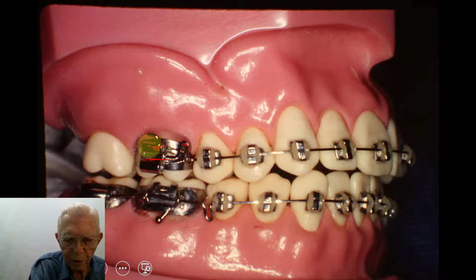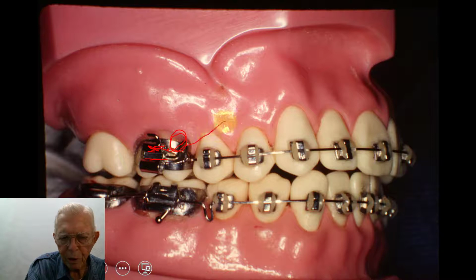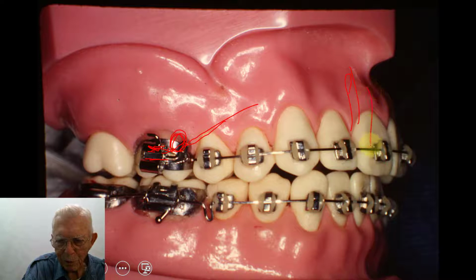Now this one is for lip bumpers or intruding arches. You'd come out of here with something like this, and you'd have to turn it up the other direction to get it tight. You'd have to come like this, and then you come up here and you tighten that spring. You tighten the spring up as you want to intrude the teeth from that. It fits in the other arch.